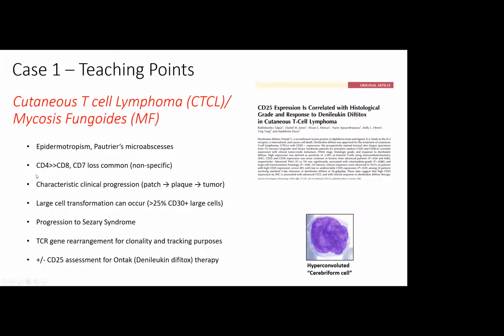This is a CD4 positive T cell lymphoma by definition, and CD7 loss is common, but remember that CD7 loss is a non-specific finding. It's seen also in reactive T cell proliferation. So you can't hang your hat ever on the loss of CD7.